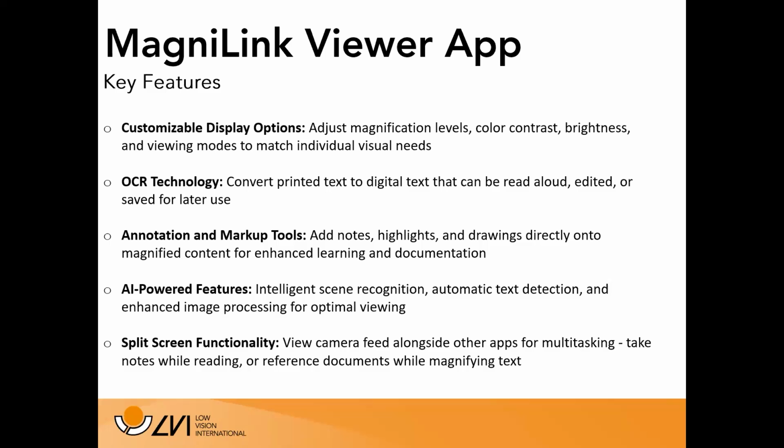For instance, if you have a college student who is using one of our cameras and the iPad to record a lecture and using that distance functionality, they may have that part on one side of the screen. And then on the opposite side, maybe their favorite note-taking app like OneNote or Notability to be able to take those notes within that college class environment.